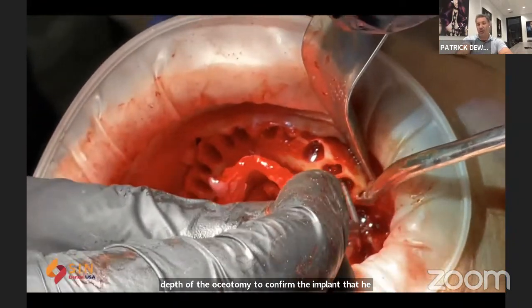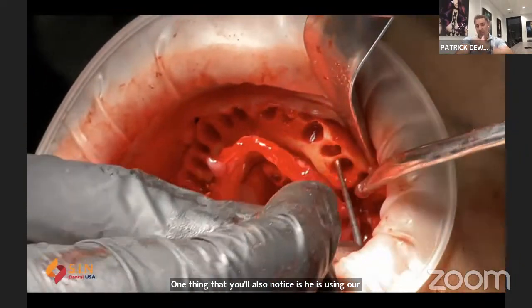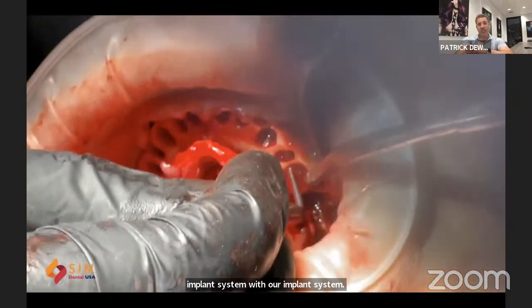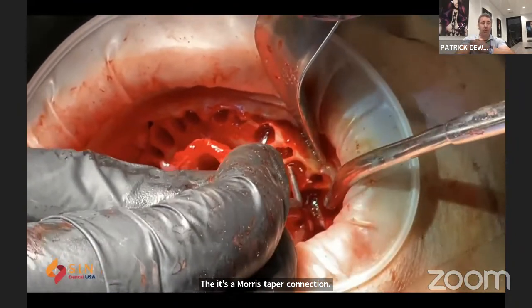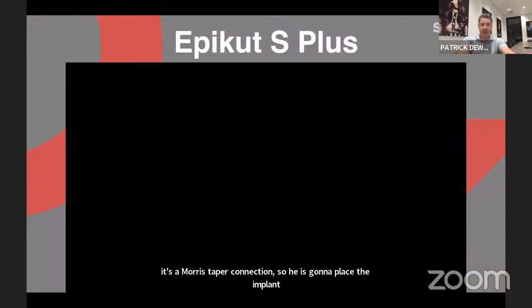One thing that you'll also notice, because he is using our implant system, it's a Morse taper connection, so he is going to place the implant subcrestal as well. Here's the implant system that we're using today in this case.